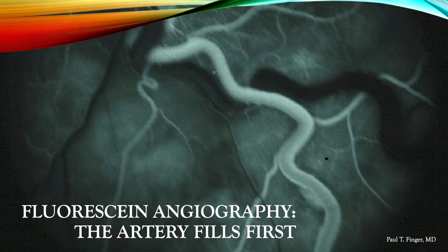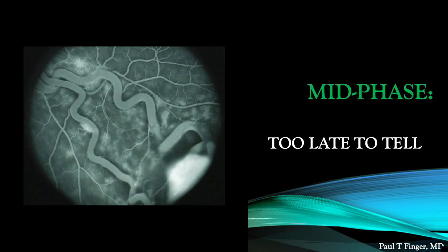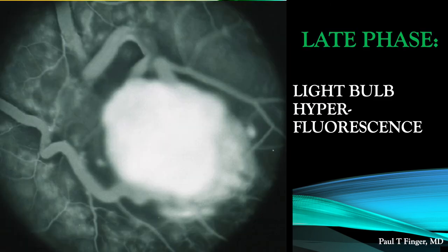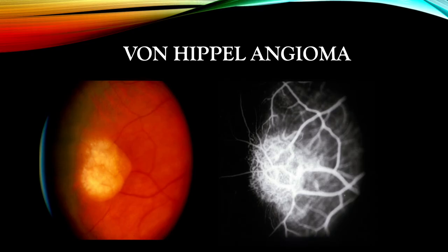In this early phase fluorescein angiogram, the artery is perfused and the vein is not. In the mid-phase angiogram, it already shows how difficult it can be to differentiate the feeding artery from the draining vein. In the late phase, as the tumor blood vessels leak, it appears like a light bulb of hyperfluorescence with leakage into the overlying vitreous. Note the yellow retinal tumor with dilated afferent and efferent blood vessels. Though this is an early phase angiogram demonstrating the lacy intrinsic vascularity of the tumor, it is already too late to reveal which is the artery and which is the vein.